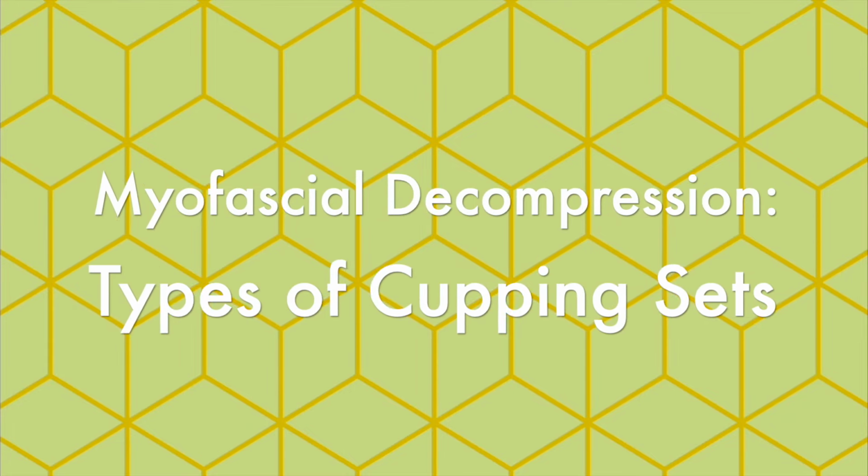Today, I'm going to be discussing myofascial decompression, also known as cupping. There are two types of cupping sets that you may find us using at our clinic. It will either be the silicone cups or the plastic cups.